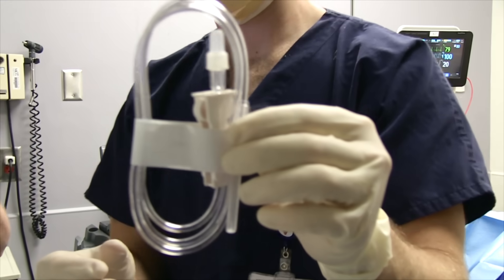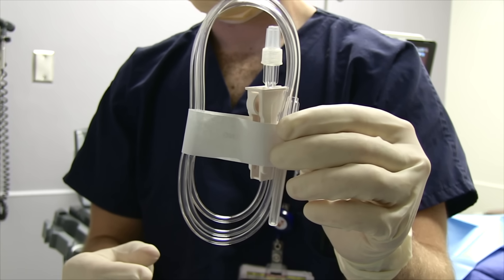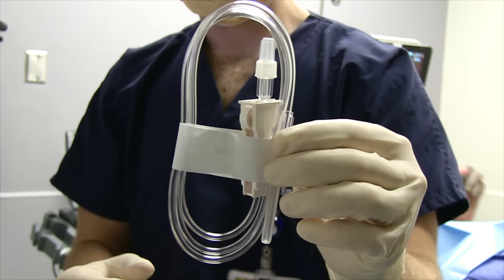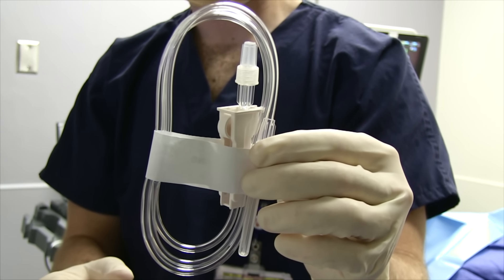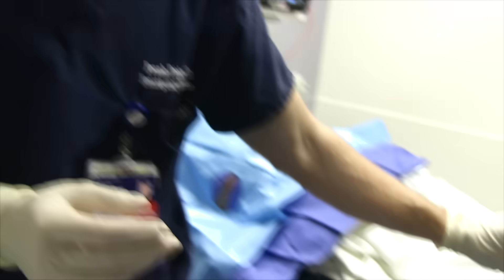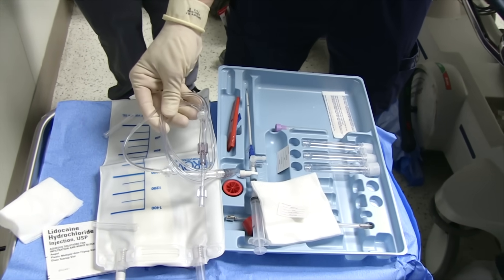There are two ways to take fluid off. You can use vacutainers — you'd use this tubing to puncture into the vacutainer and it'll suck out the ascites. But we're not using the vacutainer today; we're using the pump system. So this tubing here — we'll drop that on the bed and get it out of the way. We're going to use this tubing and this bag.